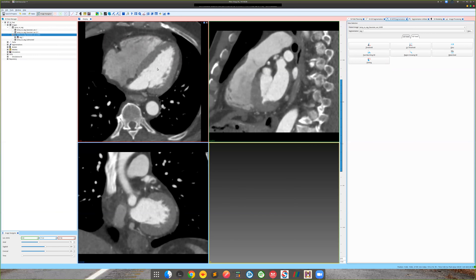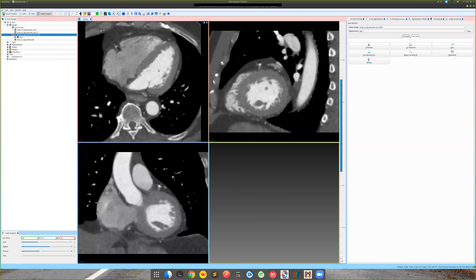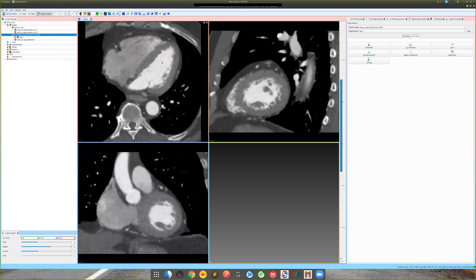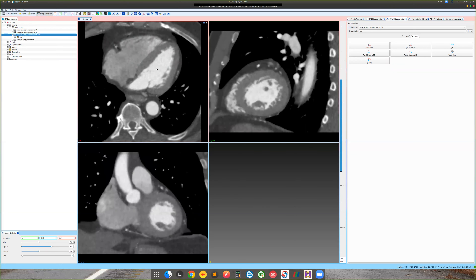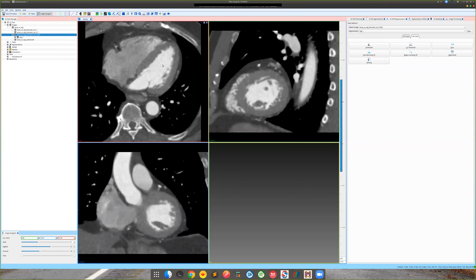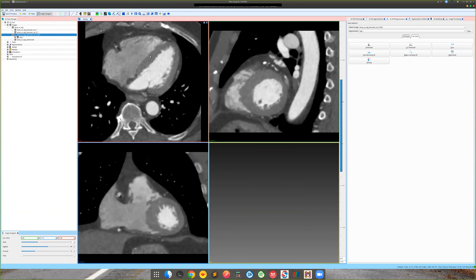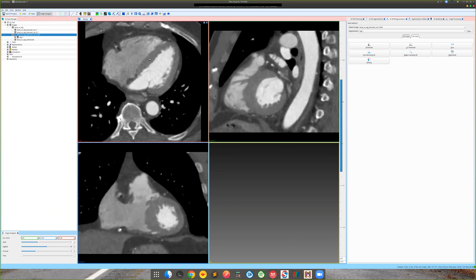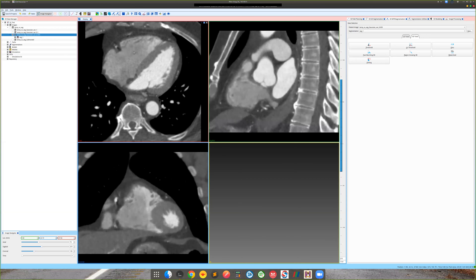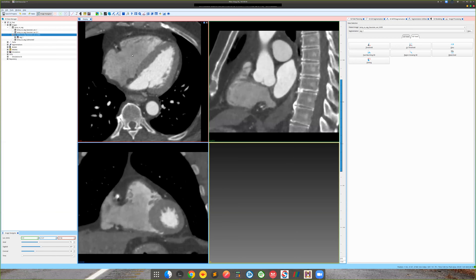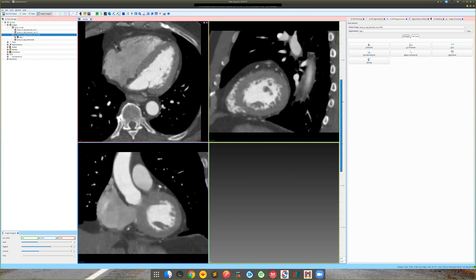To choose thresholding, click into any point with the mouse — in the bottom right corner you'll see the pixel value. For lumen segmentation, the pixel value is roughly over 600. For tissue — for example, the left ventricular myocardium — pixel values are less than 200. The right ventricular lumen is around 250 or so. We'll go over a couple of threshold options and see what is included and excluded in the segmentation.